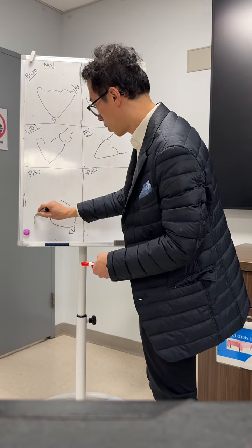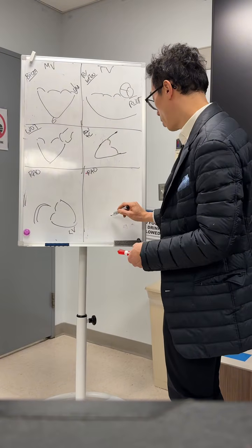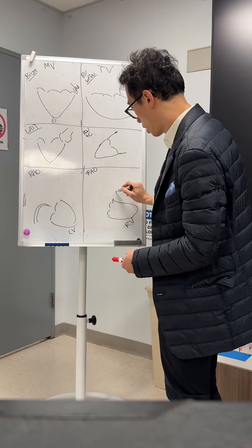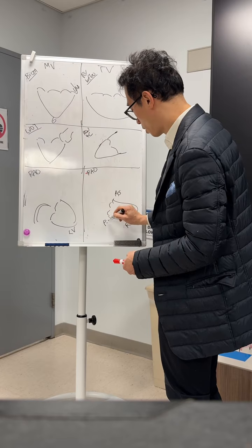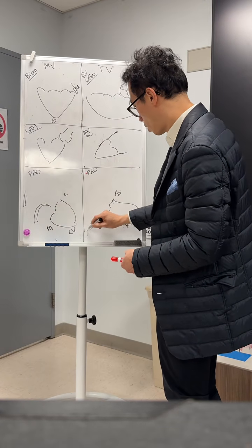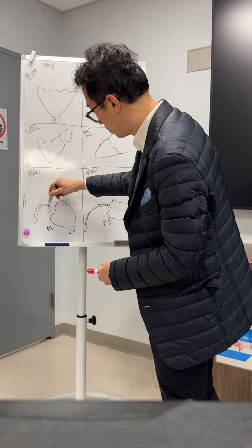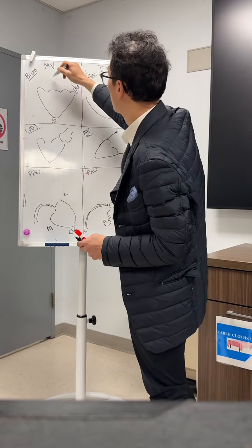The device will be here. And then here will be your RV. This is AS, this is PS. Remember, this is lateral, this is medial, and then your device would be, let's say, like that. So let's assume the most straightforward scenario.